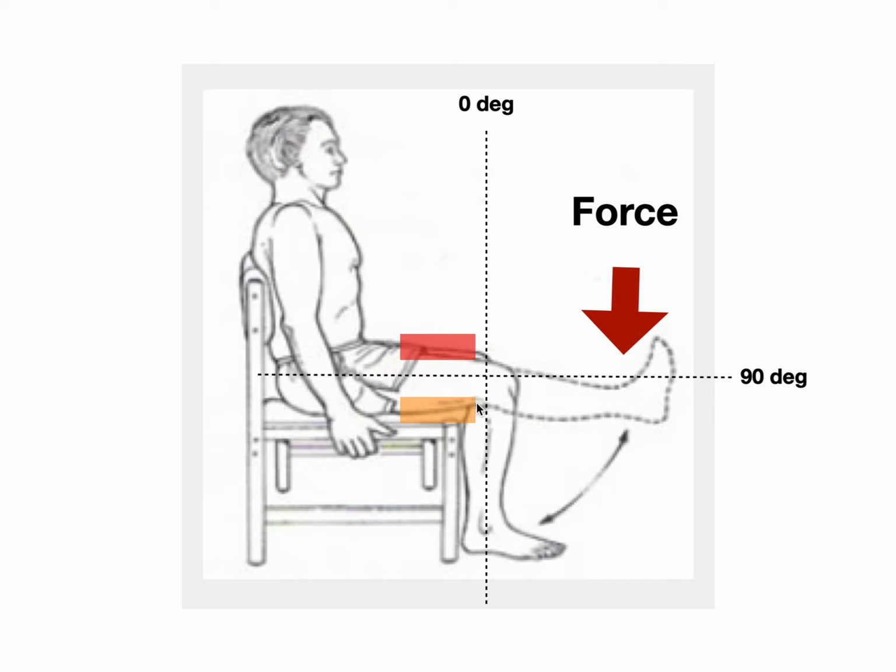And we're going to put 2 electrodes on the thigh. So that'll be one for quadricep and the other for hamstring. And then we're going to apply a force here, and he's going to lower his foot. So that's basically doing knee flexion, but controlling the motion. So think about what we got in exercise 1 and apply it to this example.